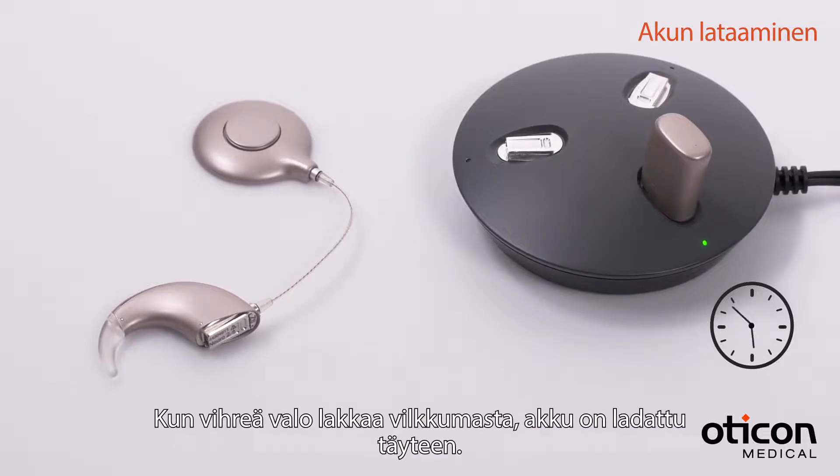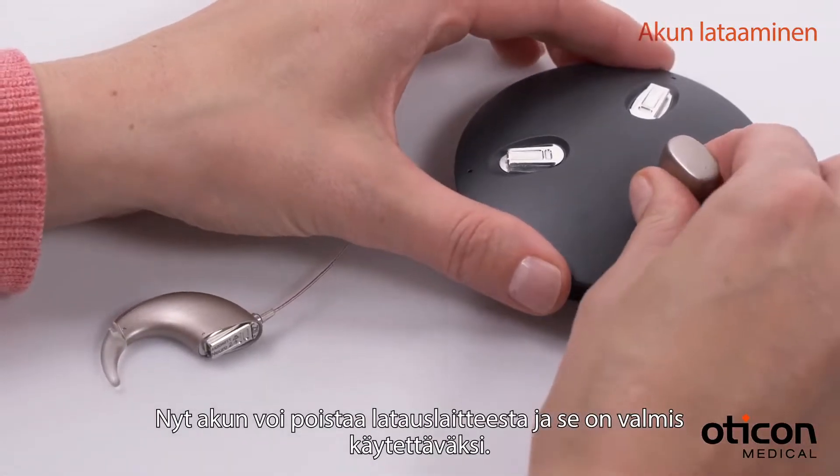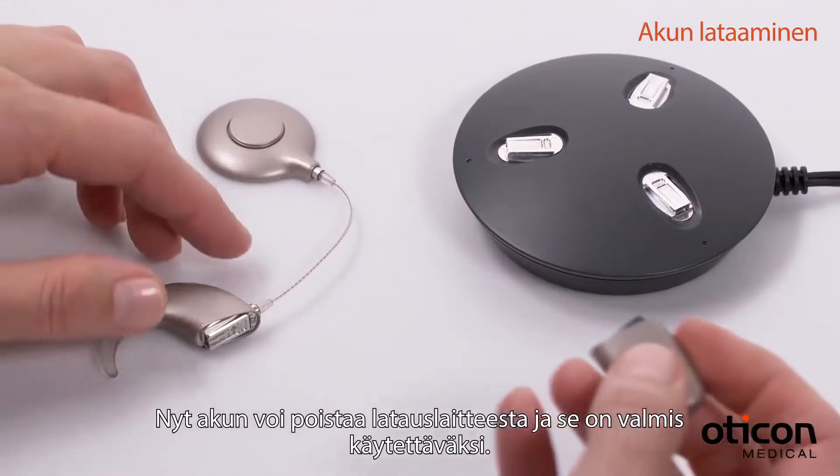When you see a steady green light, the battery is fully charged. Then you can slide the battery module off and the battery module is ready for use.